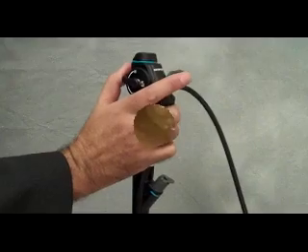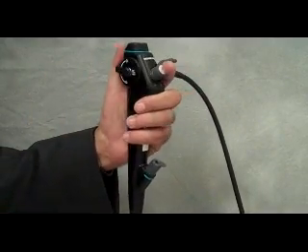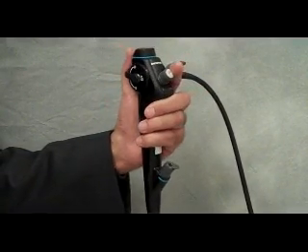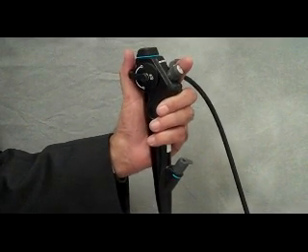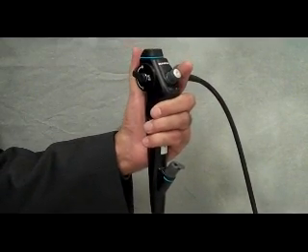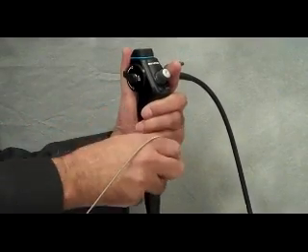The scope can be held in either the right or the left hand. Some people prefer to drive the scope with their dominant hand, while others prefer to use their dominant hand to manipulate accessory instruments. Regardless, remember that the hand holding the scope does all the work and that the other hand simply stabilizes the scope at the insertion site and manipulates other instruments.